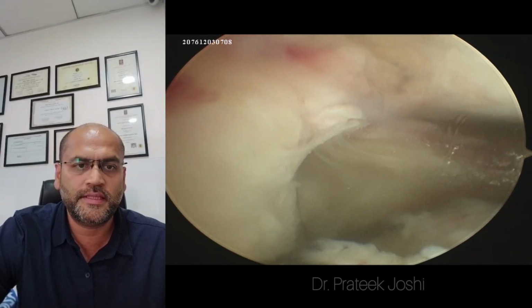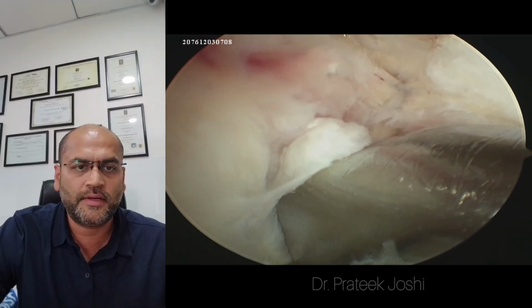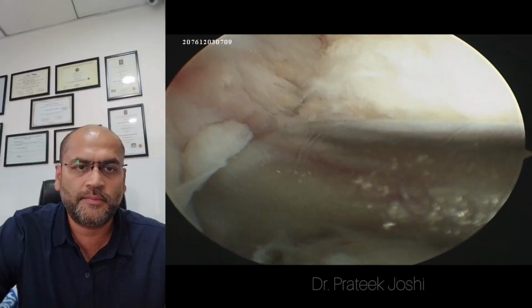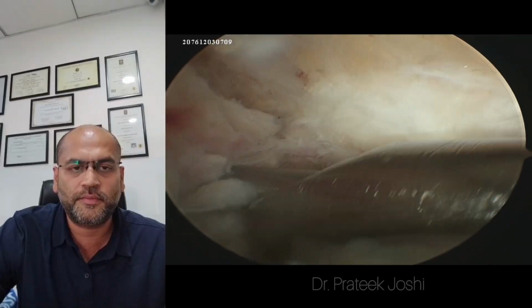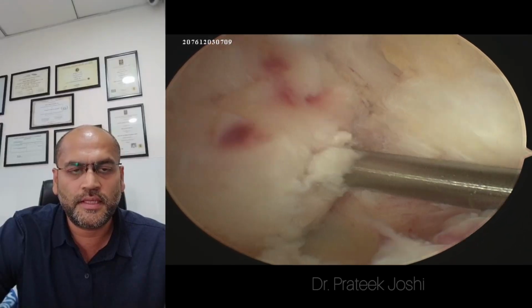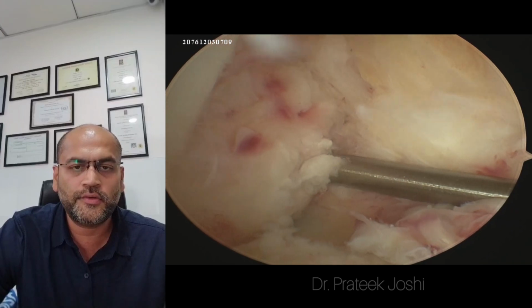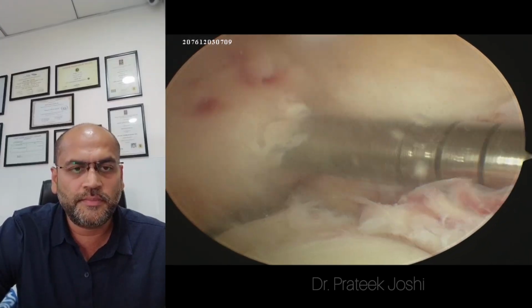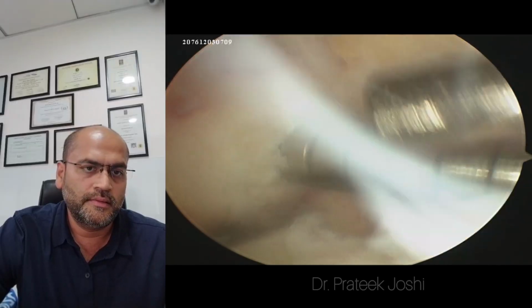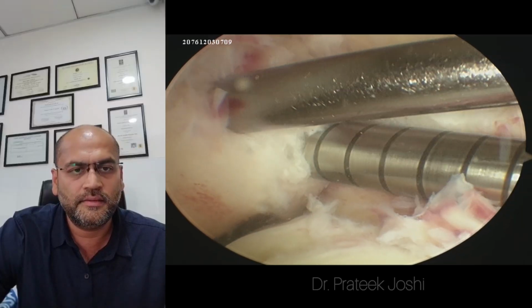Now I have inserted the femoral aimer through the anteromedial portal, which is 7 mm offset, and I am going to use a guide wire through the femoral aimer to drill the guide wire from the lateral femoral condyle. As you can see, I have drilled the guide wire through the femoral ACL footprint through the lateral femoral condyle. Now I am going to use an endobutton drill bit over the guide wire to drill over the lateral femoral condyle. This is going to create our femoral tunnel for the ACL.